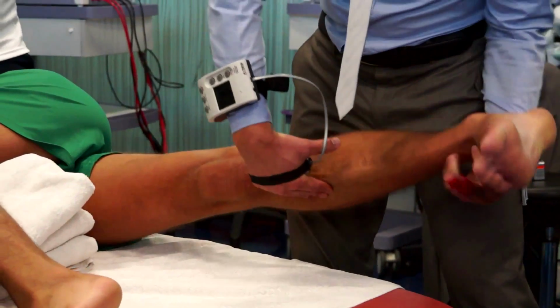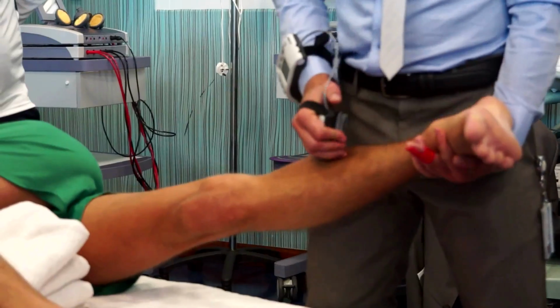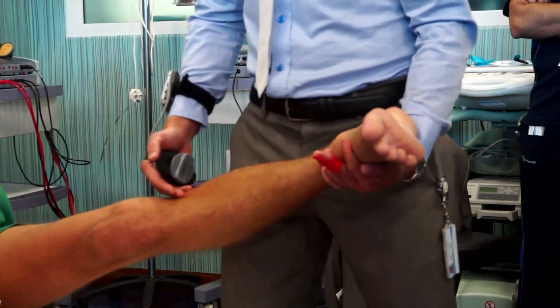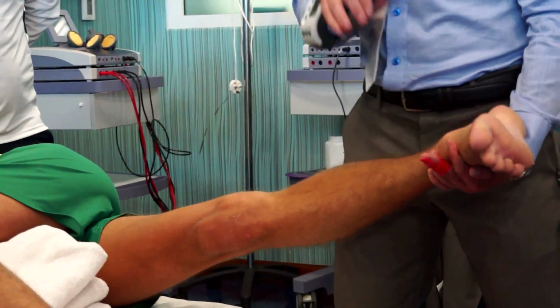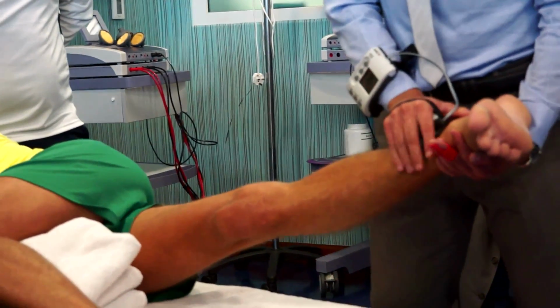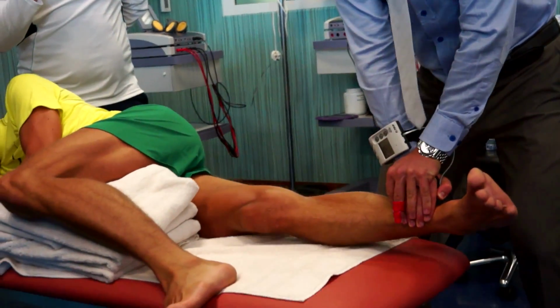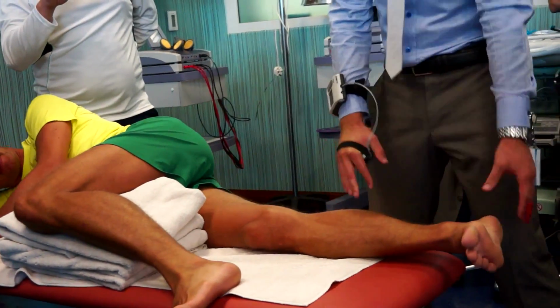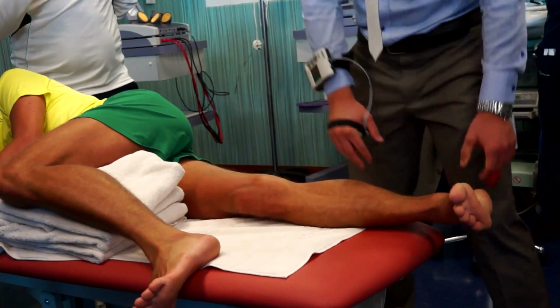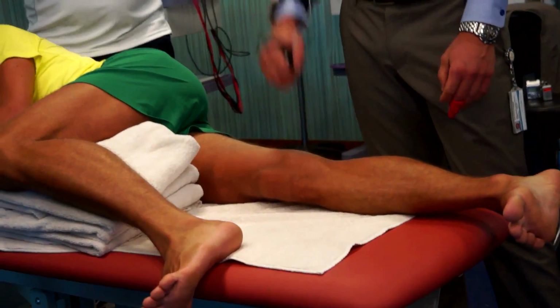You take it all the way up to maximal adduction, and then you start the measure as before with an isometric contraction, and then you push down. So are you ready? You use the mark that you made before, and go ahead. Push, push, push, push. Very good. So you stop right before you hit the bed, and you can see his adductors working in here as well. And then you get the measure.